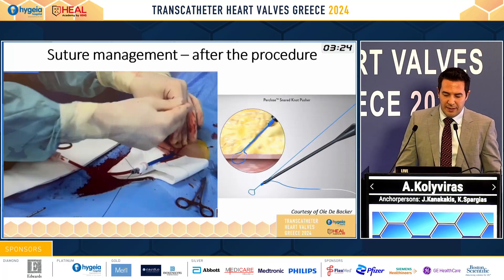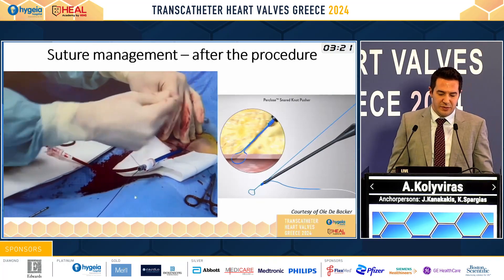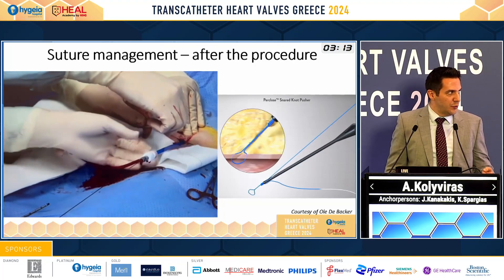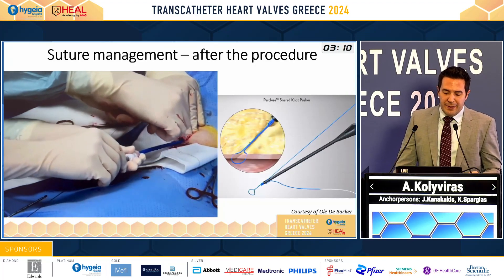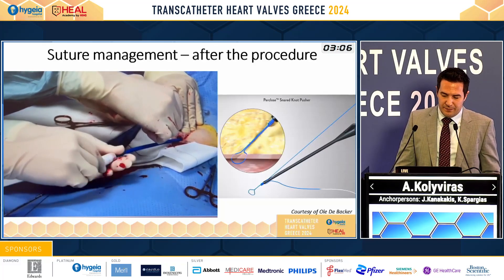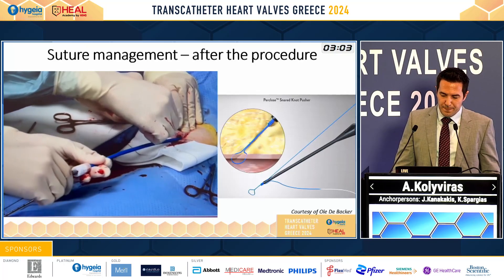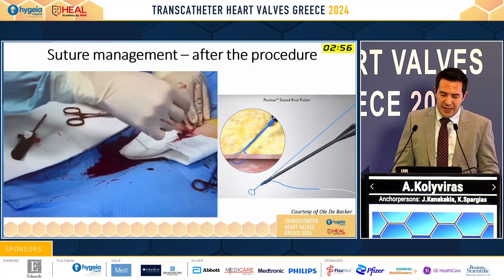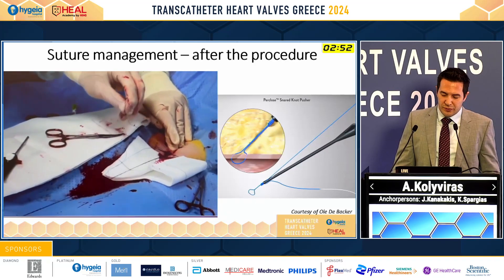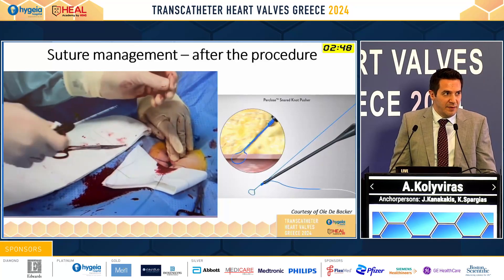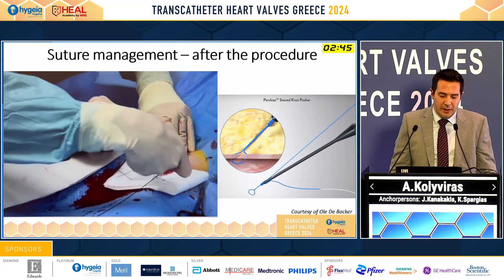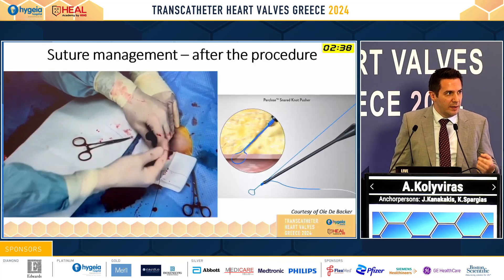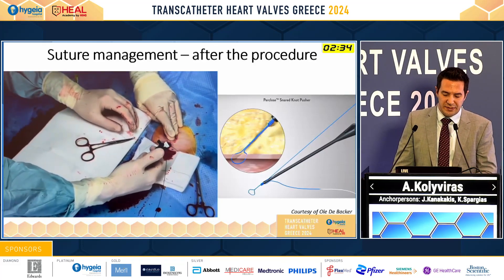At the end of the procedure, we have to manage the sutures. We recommend doing this with two operators: one operator manages the suture and the second operator pulls back the large-bore sheath. Using a knot pusher device, we push down the knot to close the arteriotomy, and we repeat this several times with one suture and the other. We keep the guide wire for safety reasons at first, and if hemostasis is achieved, we pull back the guide wire, repeat this procedure, and cut the suture.